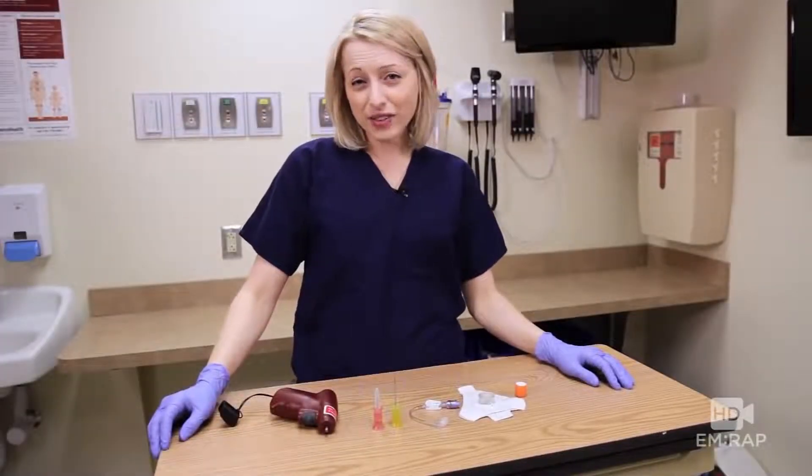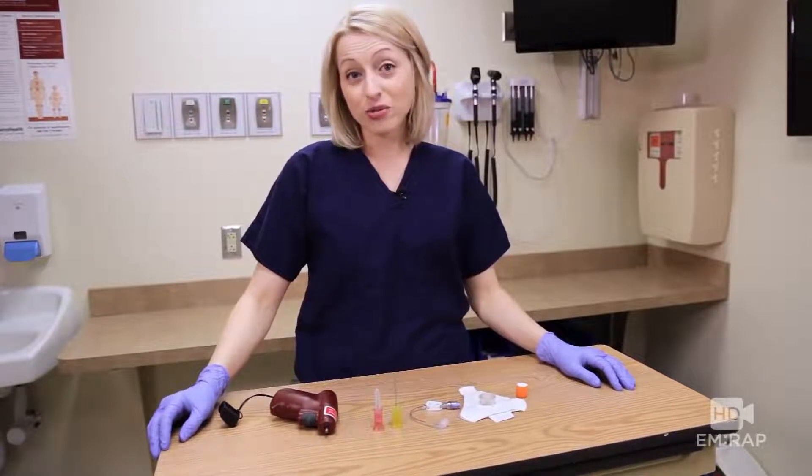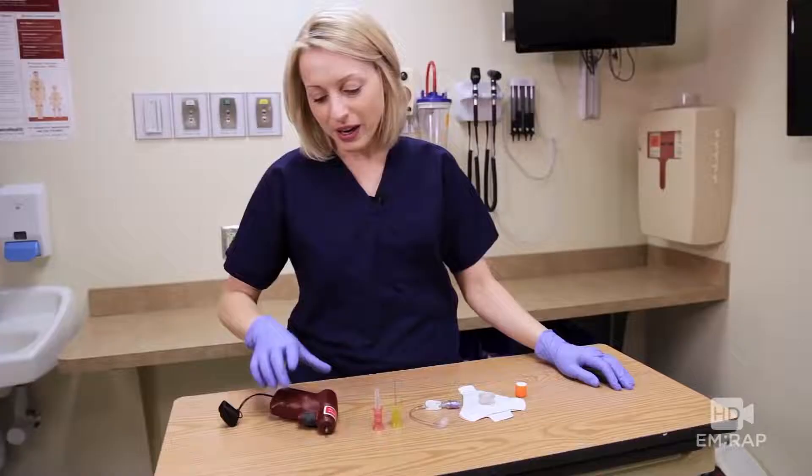I'm Dr. Jess Mason and this video is going to show you placement of an EZIO in a real patient, in a real code, in a real hospital. But first, before you get too drill happy, let's go over what's in the kit so you know what to expect.